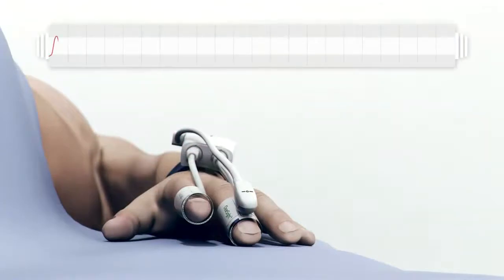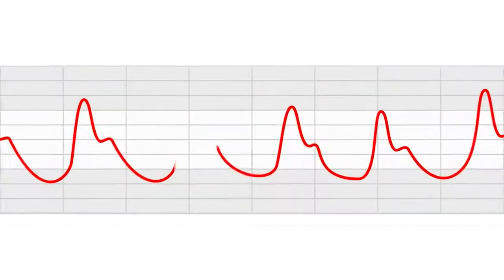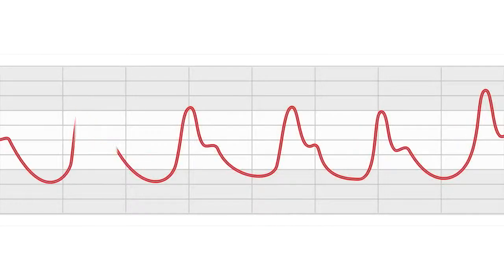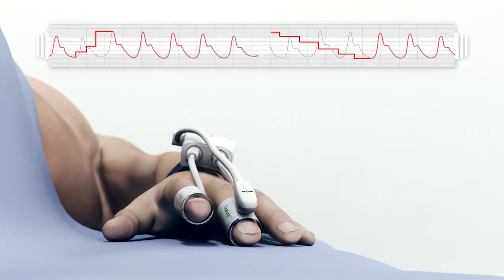When measurements are initiated, the ClearSight system runs Physiocal, the real-time process which calibrates the blood pressure measurement by determining and periodically updating the target unloaded volume, known as the set point. A red line represents Physiocal and a gray line represents a traditional radial arterial line pressure reading for comparison. Physiocal will accurately mirror an existing arterial line output. The Physiocal process can be identified by its characteristic staircase-shaped waveform, indicating the system is stepping up and down in pressure to calculate the proper unloaded arterial volume. Typically, the first blood pressure waveform will be displayed on the monitor in approximately 20 seconds.